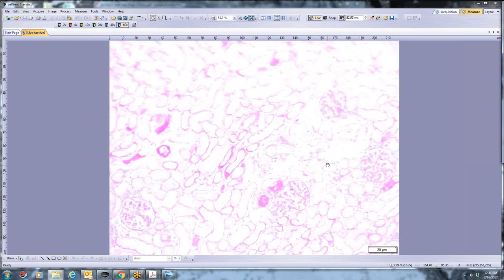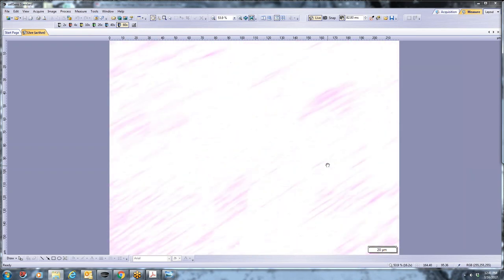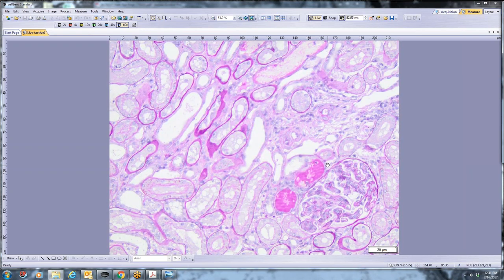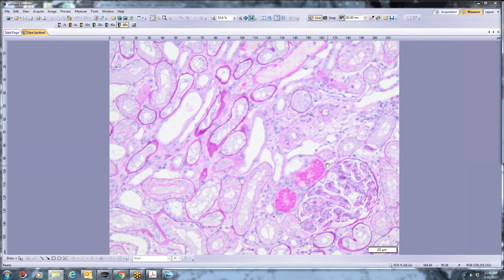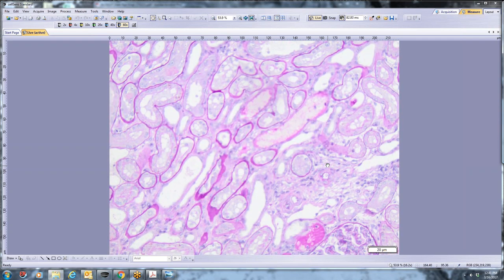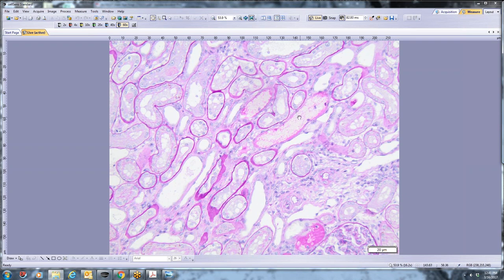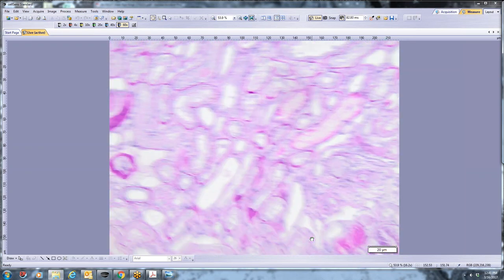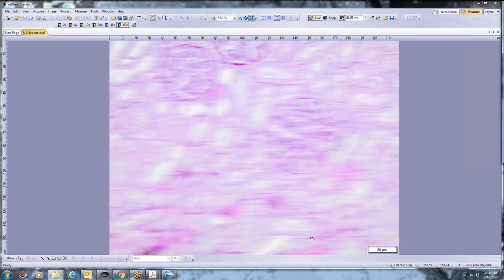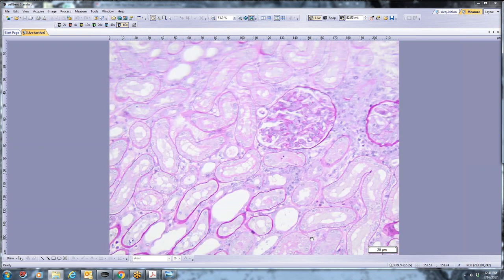One hint for the aspiring pathologist in the room is that the cool thing about this stain is PAS will stain protein casts, but it doesn't stain the red cell casts. So if you're ever saying, I wonder if this is a true red cell cast or if I think this is a protein cast, you'll be able to go to the PAS stain and say, oh, all of this here are red cells. Because the PAS isn't staining it, it's got to be a red cell cast, whereas it will stain the protein casts densely pink.